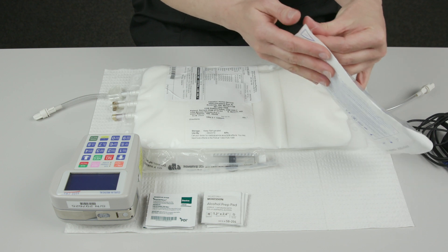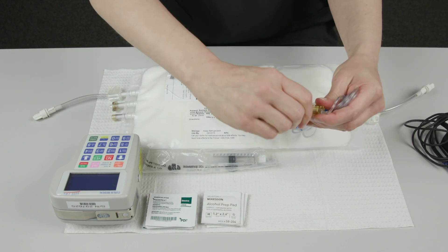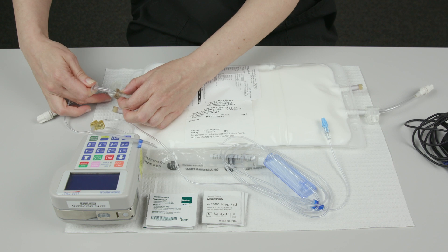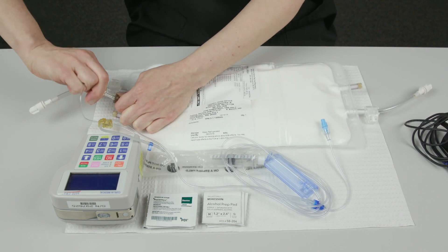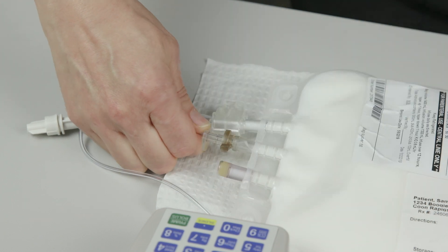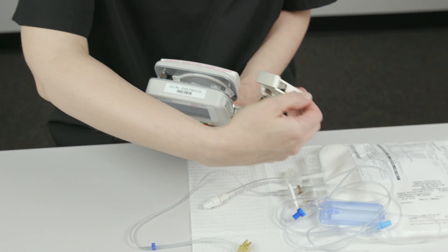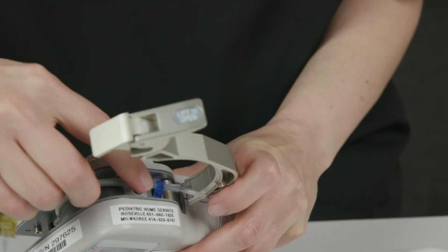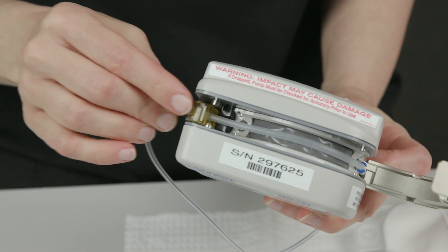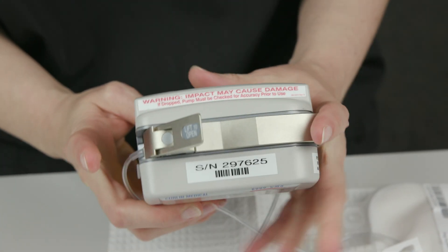Remove the Curlin IV tubing from its package. Twist to remove the tab from the yellow flow stop device in the IV tubing. Pull to remove the cap from the IV tubing spike. Push the tubing spike into the tubing port on the HPN bag using a twisting back and forth motion. Keep pushing and twisting the spike until it reaches the HPN fluid in the bag and cannot be pushed any further. Lift the latch on the top of the pump to open the pump door. Insert the blue tubing guide into the holder on the right side of the pump. Lay the tubing in the center of the gray track. Insert the yellow flow stop device into the holder on the left side of the pump. Close the pump door and press the latch down until it clicks.